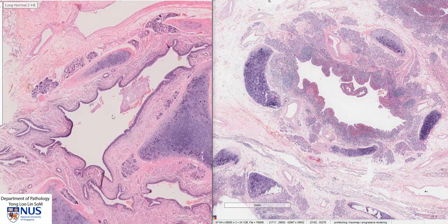At lower magnification, we can see that this abnormal bronchus on the right appears much bluer, and this is because of the marked inflammation in the wall of this bronchus.